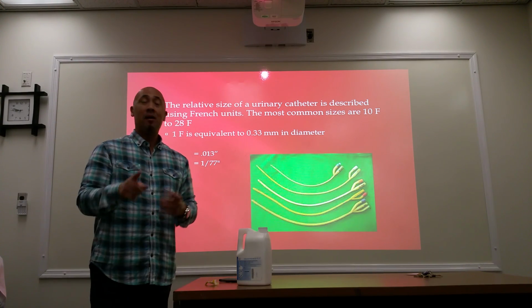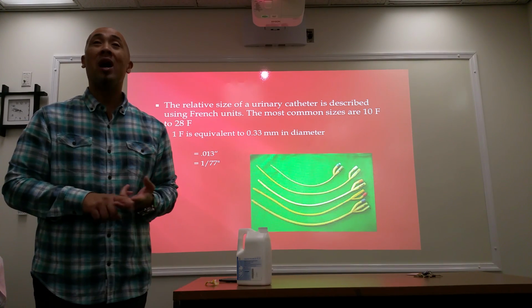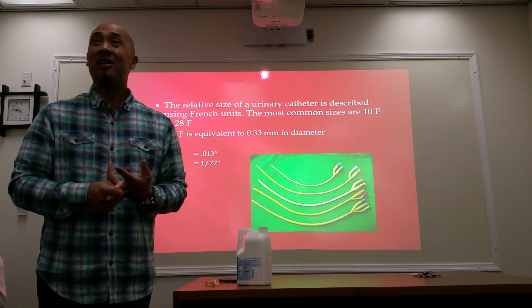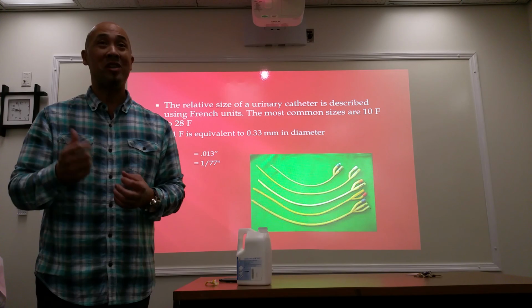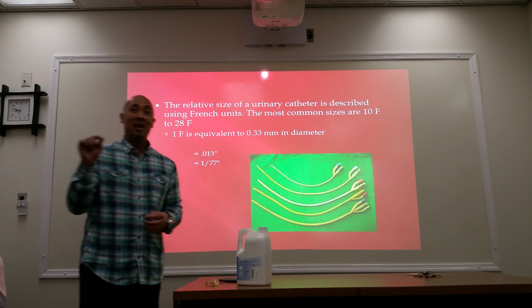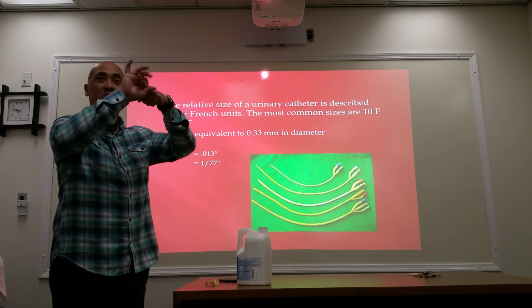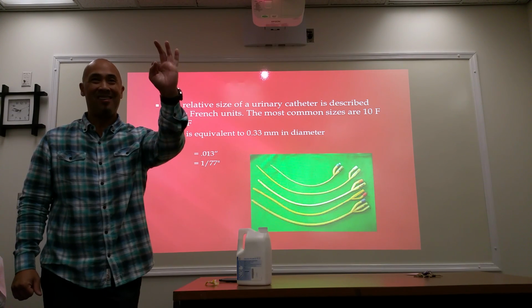Well, I looked it up, and what happened was when they made needles, they adapted the wire industry practice. Because when you talk about wires, the diameter of wires is measured in gauges. So the number was associated with how many times they needed to draw that wire down to get it to the smallest diameter.